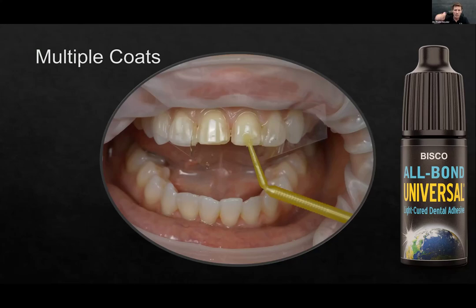You'll notice here, I'm putting on multiple coats. You can see it pooling on the tooth, right? I'm not worried about a couple of extra pennies or dollars here. I want to make sure this works extremely well for the patient so they're happy and it lasts a lifetime, or at least a long time.